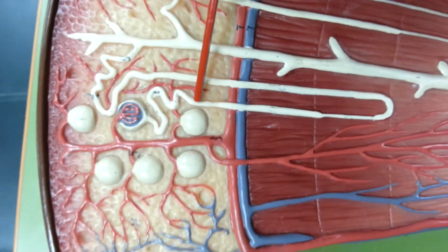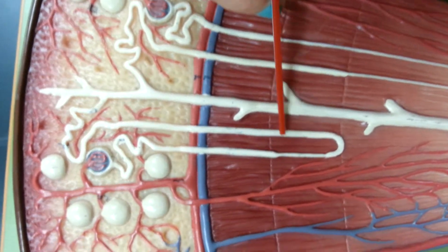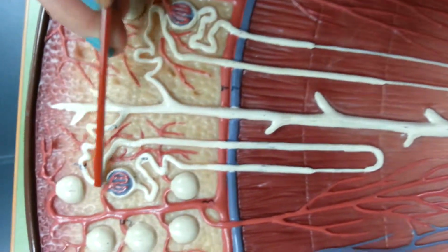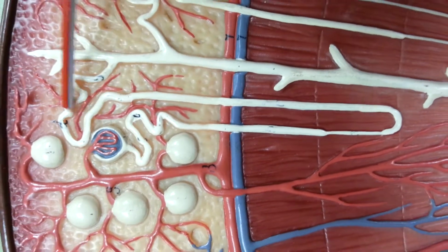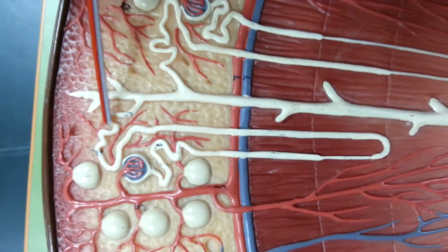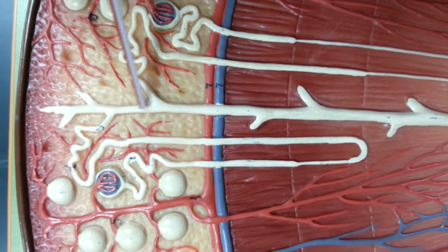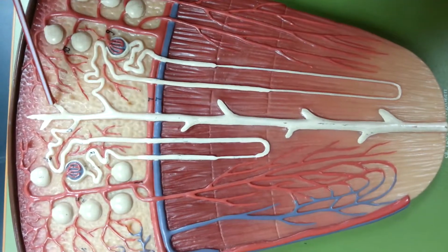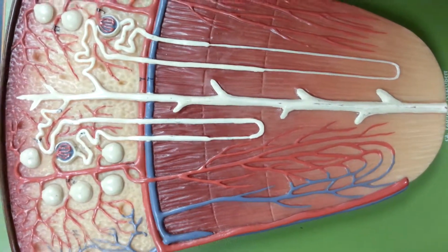So segments of that, you've got the descending limb coming down, and then it turns, and you've got the ascending limb coming back up. Now you hit this other tubule that's very wiggly, and the fluid has already traveled pretty far. So this is the distal convoluted tubule. From the distal convoluted tubule, you've got this little straight gap right here, and that is your collecting tubule that runs into the collecting duct. Each nephron has its own collecting tubule, and then those collecting tubules come together to form the collecting duct, which will eventually take the fluid into the ureters.